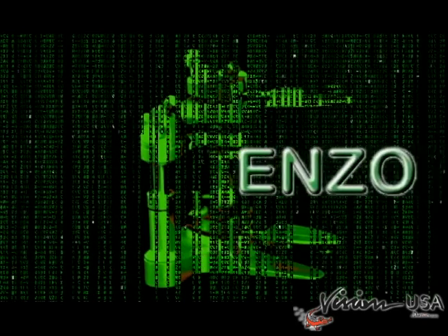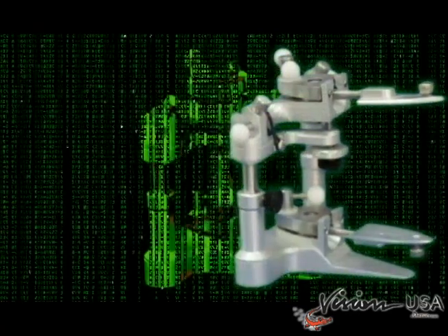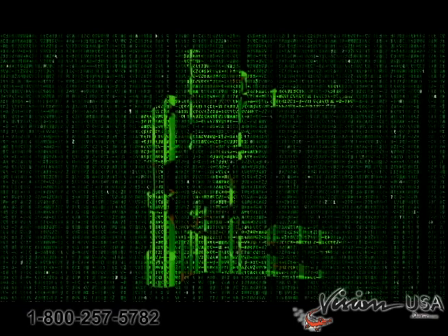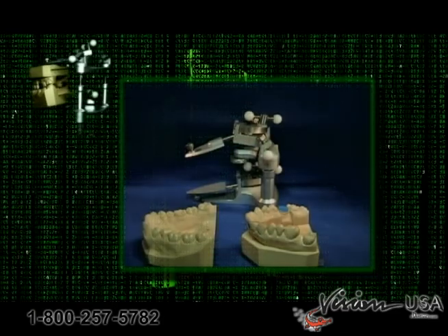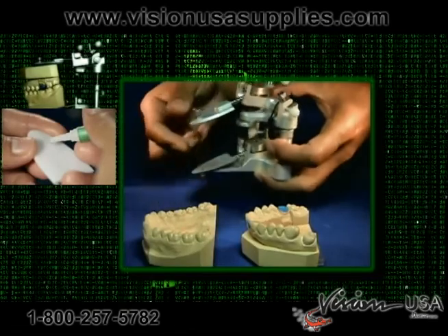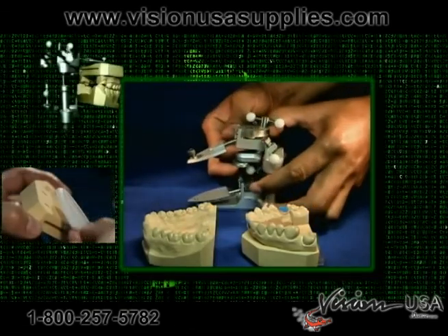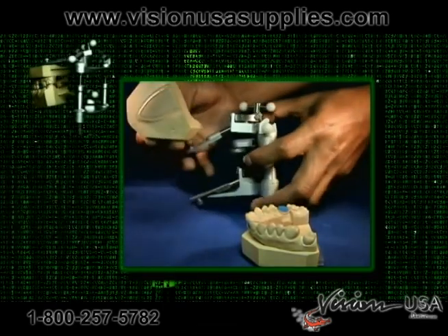The Enzo Universal Plasterless Articulator — one articulator for full arch and quadrant use. It features plastic universal disposable bases that are easily glued to any model with a flat surface.